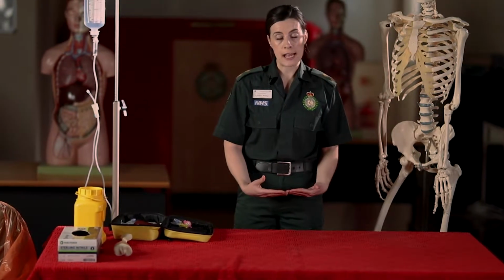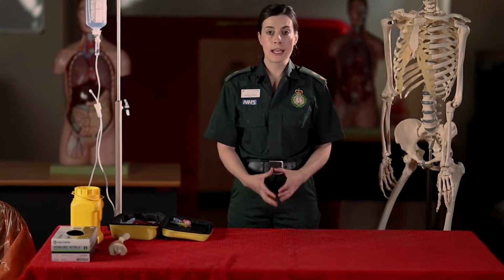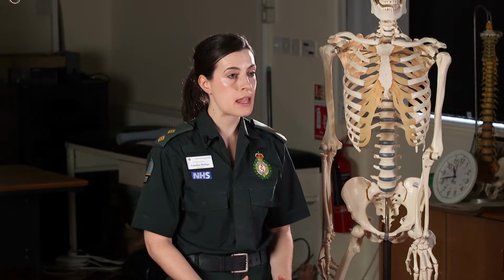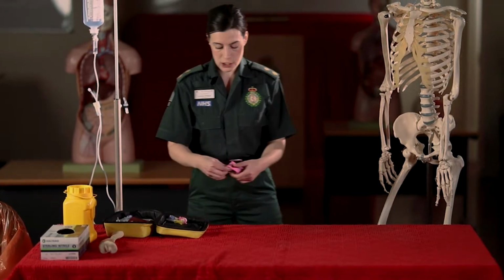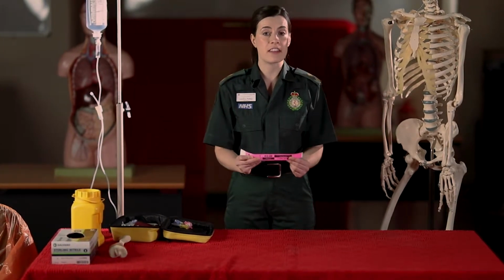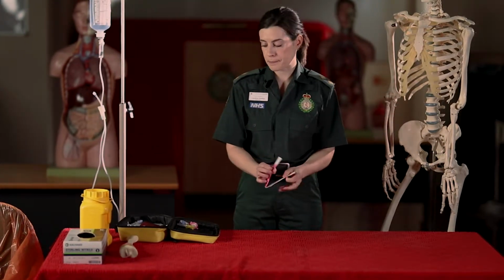The right aftercare involves us paying close attention to the site, keeping an eye out for any signs of tissuing or any signs that the site may not be patent. If the needle becomes dislodged, remove the needle, and make sure that we attach our pink wristband onto the patient once we have either attempted or successfully gained our EasyIO port.